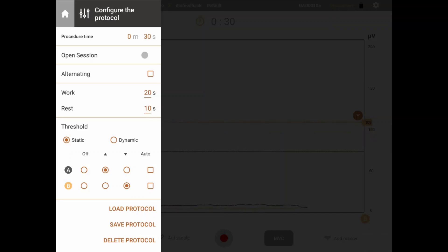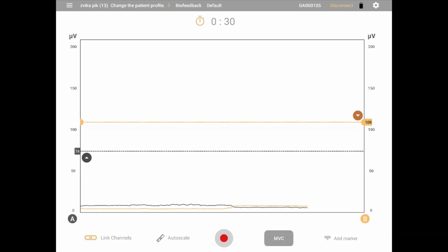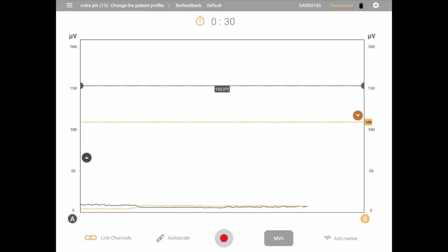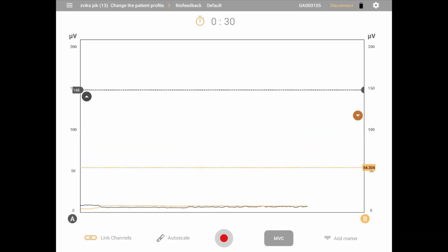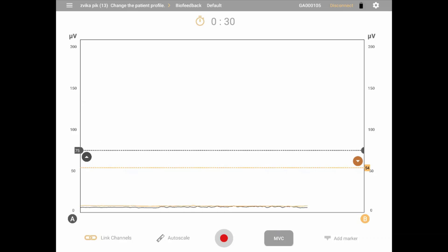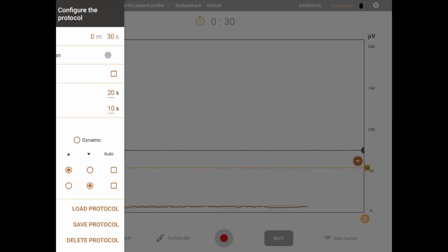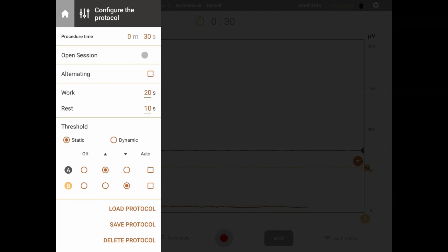Thresholds provide a goal for the patient to reach with the signal. Threshold adjustment is done on the main preview screen — click on the threshold once and two dots appear on the sides of the line to signify it is selected. You may then drag and drop to move the threshold to the desired value, which can also be done during a session in most cases, except when auto threshold or dynamic threshold is turned on. In the Myonics app, there are two basic types of thresholds: static, which is the classic type, and dynamic, which provides a moving target for the patient. There are two separate thresholds, one for each channel, and their settings and values can be selected separately.